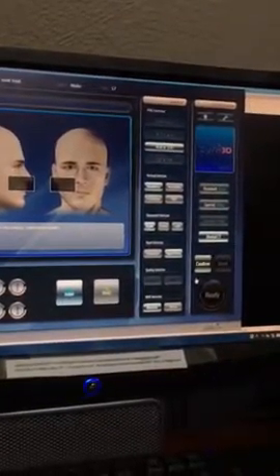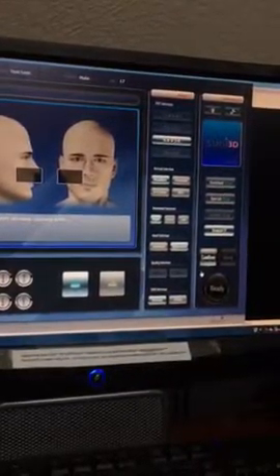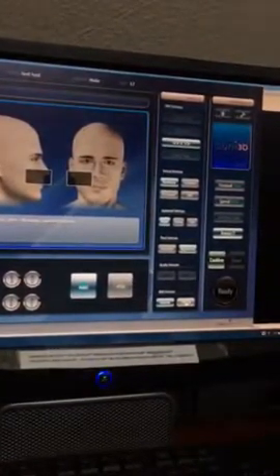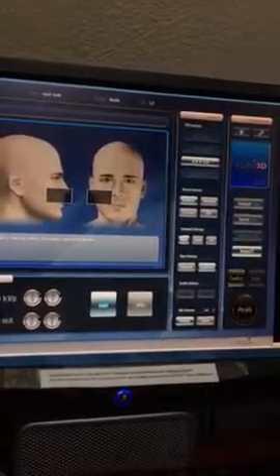If somebody has a lot of braces or retainers or things like that, obviously you can't take them out. In theory, this is supposed to reduce the scatter radiation from the metal artifacts in the patient's mouth. I say in theory because I haven't noticed a huge difference, but it's there, and there is some. If I take one in normal and one in metal of somebody, I don't know if we'd be able to tell the difference. But then the doctor might start manipulating it with the viewing software, which I'll get into briefly. There might be something to it, but that's my overall impression.